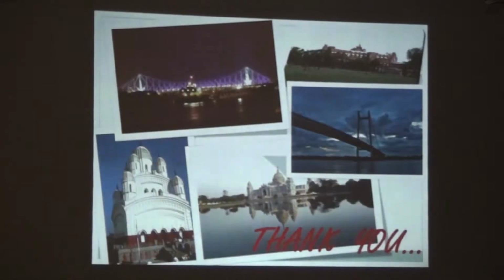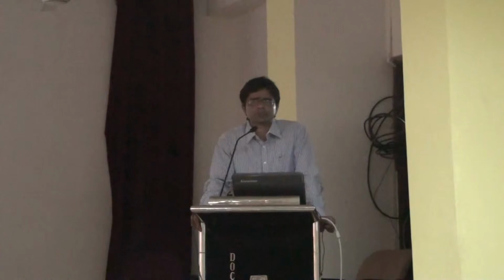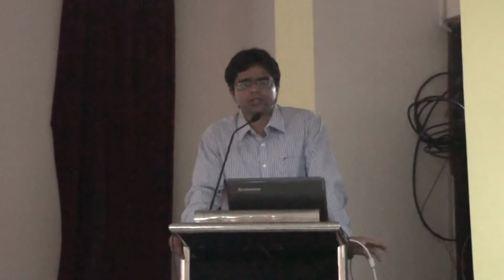In CPAP, IPAP and EPAP both are similar. Both are same. Then how to calculate the pressure? Usually we start with a low pressure setting like 2 cm H2O, and we increase. It takes around 4 to 6 cm of H2O, with the patient's comfort level.